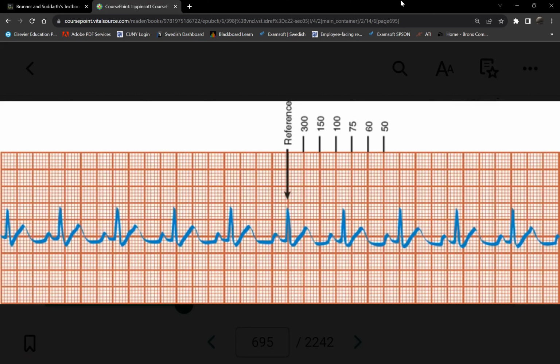That's our 6-second strip. So the fastest way, can you say that this cardiac rhythm is regular or irregular? It's irregular. What made you say irregular? Because there's no P. No, when I say regular, that means are the waves and complexes occurring about the same time each time?